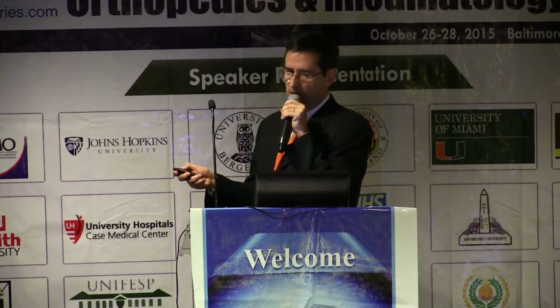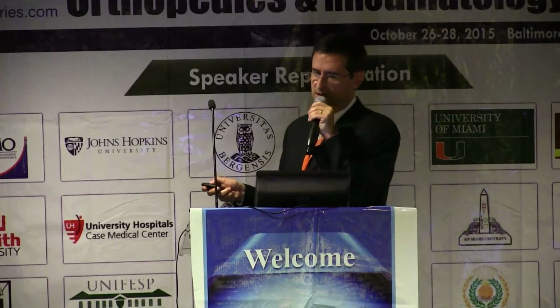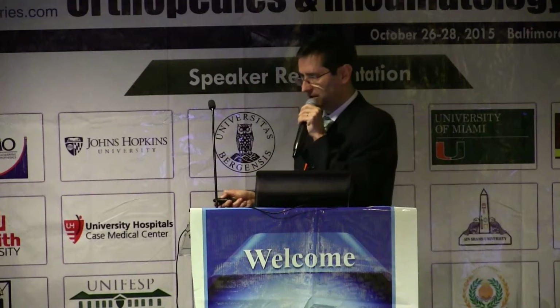The entry and the exit point of the median nerve in the carpal tunnel are thicker than the nerve segment inside the tunnel, thus resembling an hourglass form. On the axial plane, the nerve is swollen and hypoechoic in the proximal carpal tunnel, unlike the distal region, where it is compressed and hyperechoic.